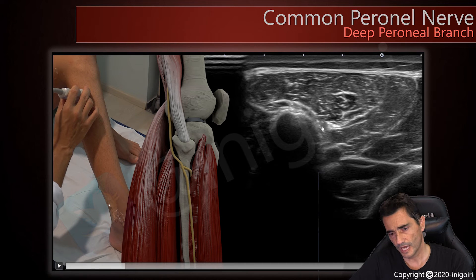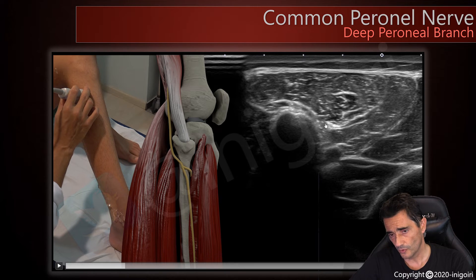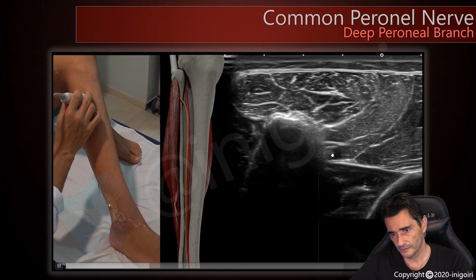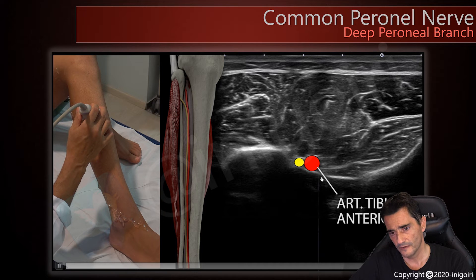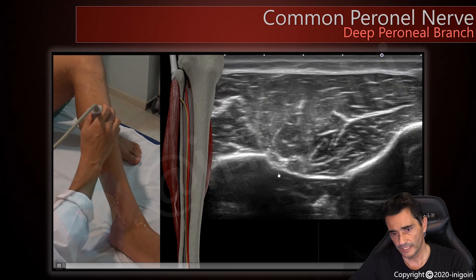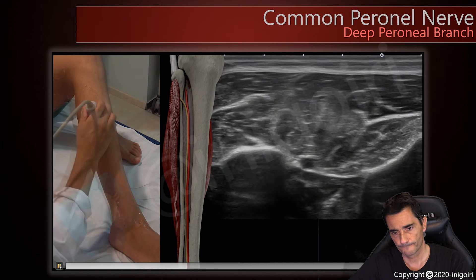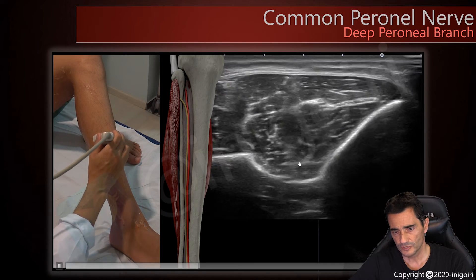— these small hypoechoic round-shaped nerves: this is the superficial branch and this is the deep peroneal nerve. It is difficult to see clearly because these two nerves, especially the deep one, move away from the probe. However, we can notice how this nerve searches for the anterior tibial artery — you can see the artery — and how the nerve runs very close to it and to the interosseous membrane.